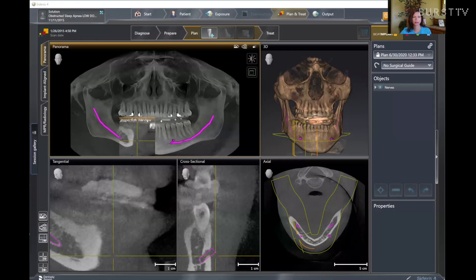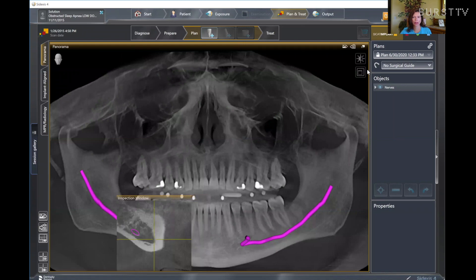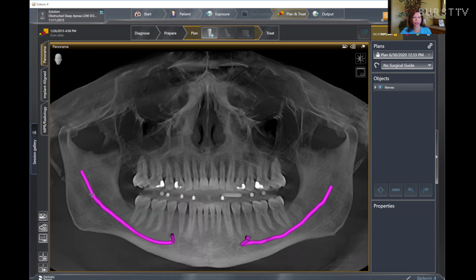I'm going to show you a couple of scans and ways to incorporate this into your practice. For hygienists, one of the great benefits of 3D imaging is to help map out the nerve for giving inferior alveolar injections. We can see the exit of the foramen and get a good visualization of where to place the injection site. If we look at this panoramic view here, we can see on the right-hand side the IA nerve, and exactly where the exit of the foramen is.